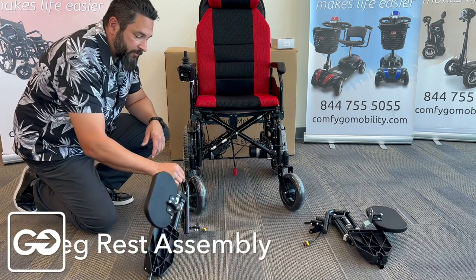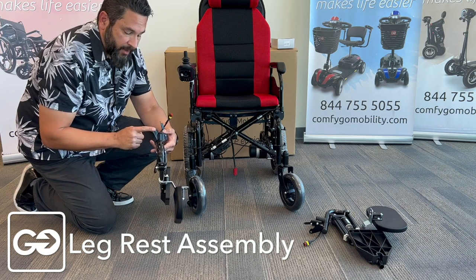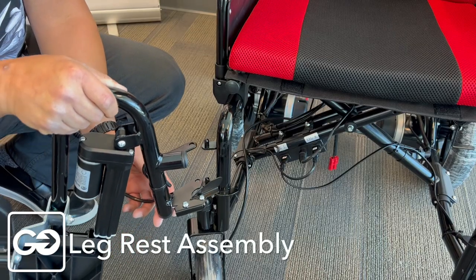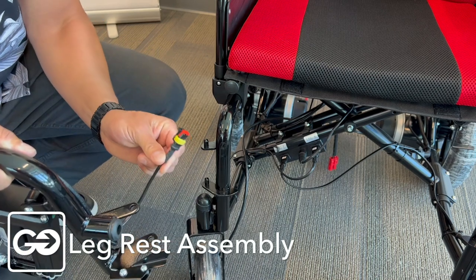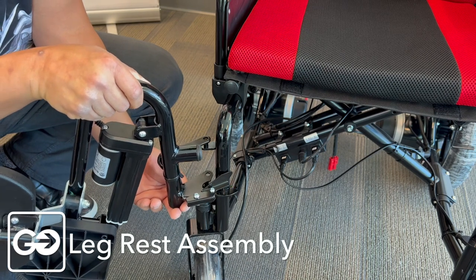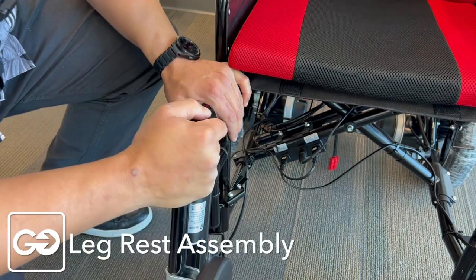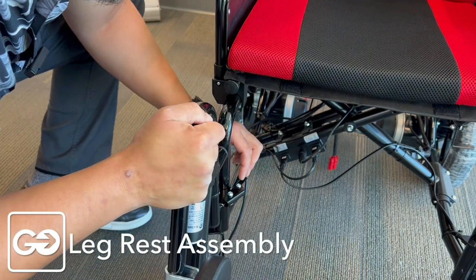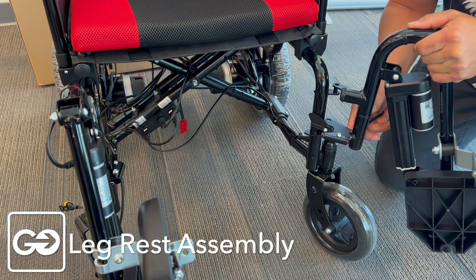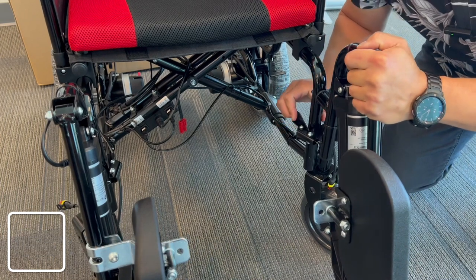Now we're going to install our two foot plates — we have a left and a right side. The easiest way to distinguish these is to look at the brackets: the brackets will be on the outside of the chair. As we're installing this onto the system where the two pins are, we want to make sure the cable goes underneath so we can plug that in a little bit later. Move that cable down to the bottom, slide this onto our two pins, push it down, then push it over. This mechanism here will lock into place — give it a little bit of tension, pull it down, and lock that in. Repeat the process for the left side.